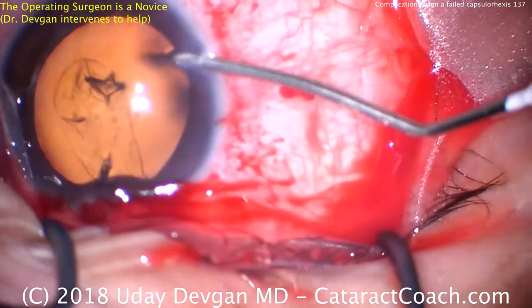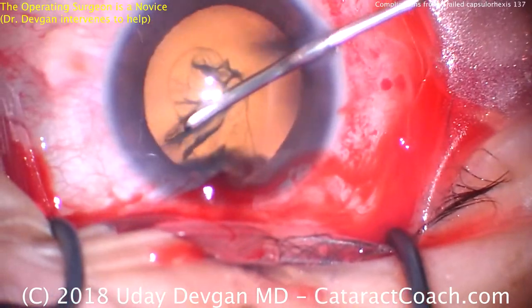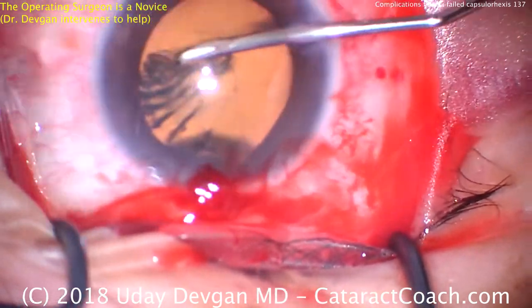What's the problem now? We can't continue this capsulorhexis and we have a large area, superiorly, sub-incisionally, that has radialized out towards the lens equator.